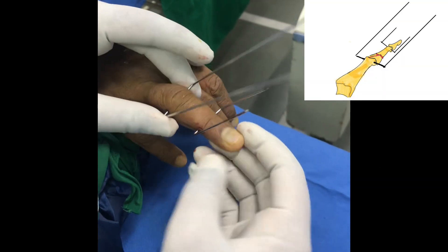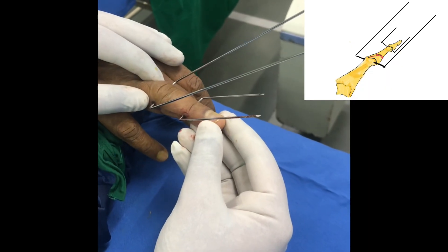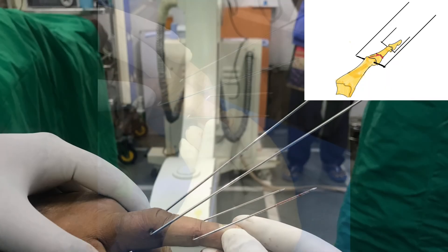The wires are then bent. Note that the proximal wire is a long wire and the distal wire is a short wire.